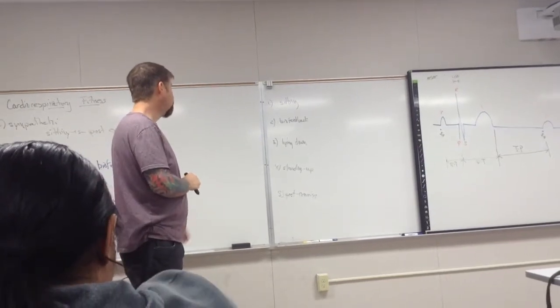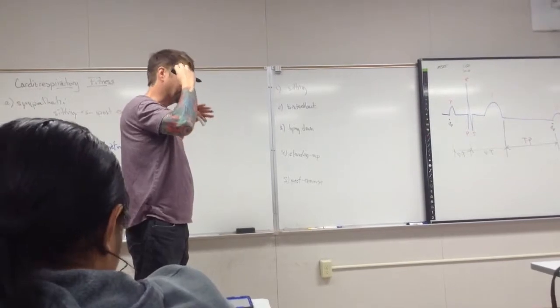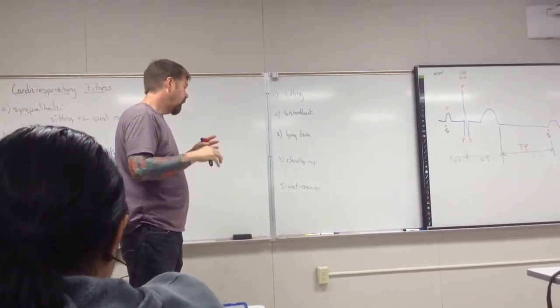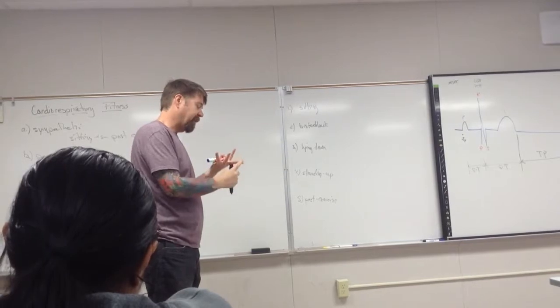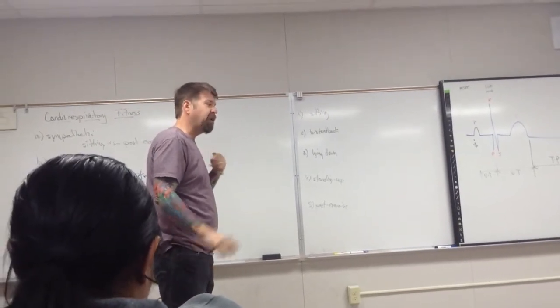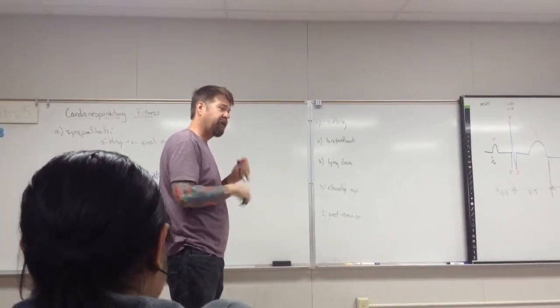What I would do is I would do everything all at the same time. Get the person hooked up to the EKG, right? Have somebody be responsible for taking the blood pressure, have somebody be responsible for running the EKG, have somebody be responsible for taking heart rates, have somebody be responsible for taking respiratory rates. So you need 4 or 5 people in a group to have somebody responsible for all of this, and then 1 test subject.